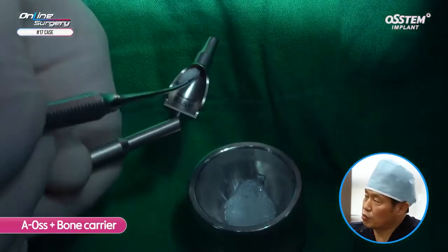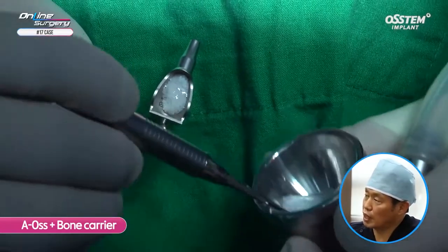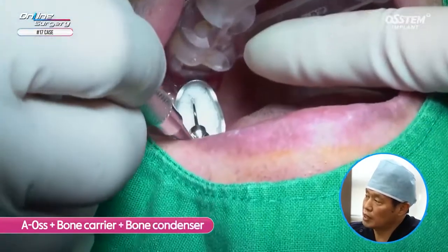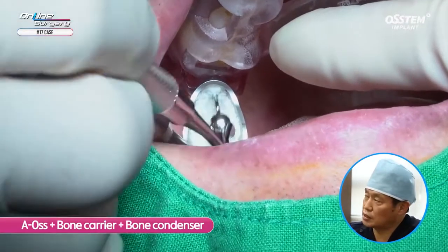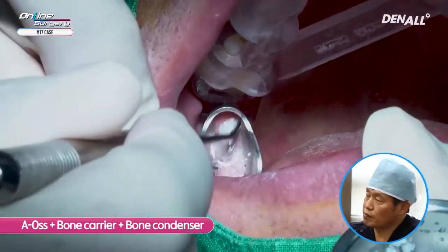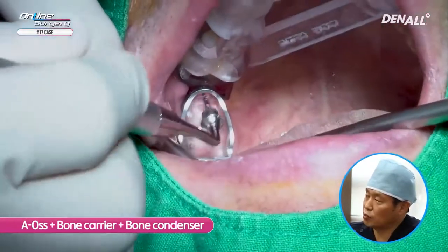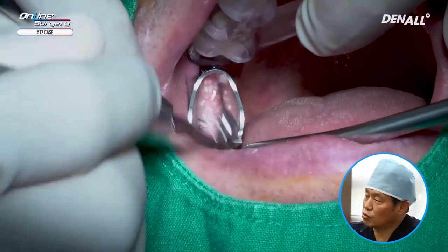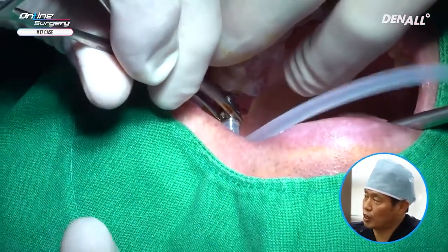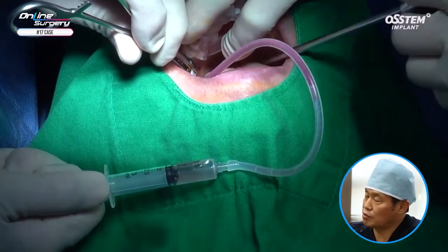I'm going to use bone carrier with bovine bone — AOS — and conduct bone graft on the sinus floor. In the past, you had to do hydrolift without the template. However, with the current system, you can keep the template on and use all sorts of tools for hydrolift and bone graft. Sufficient bone graft is done — this was made possible because there is a template. Compared with the previous CASKit, with OneCast kit there is a stopper, so there is much less possibility of sinus membrane perforation. After bone graft, I do aspiration to draw out some saline, which concentrates the bone graft material in the sinus floor.